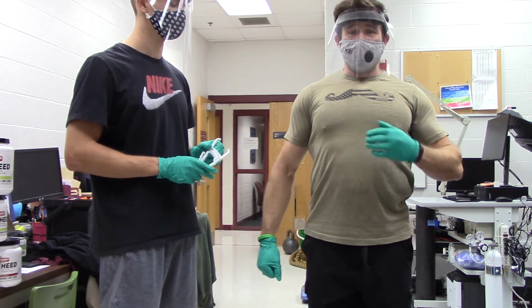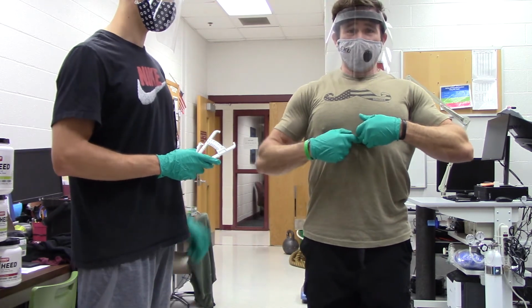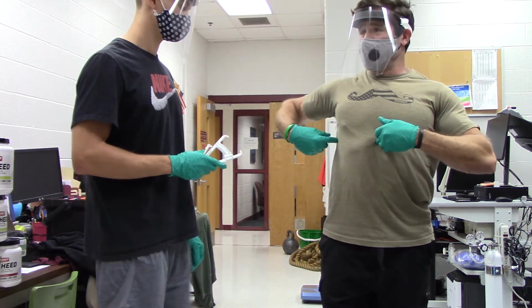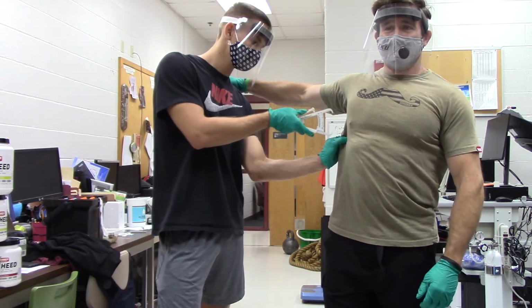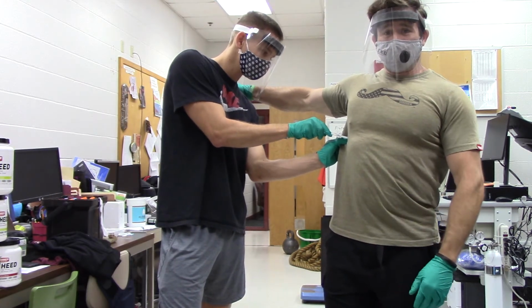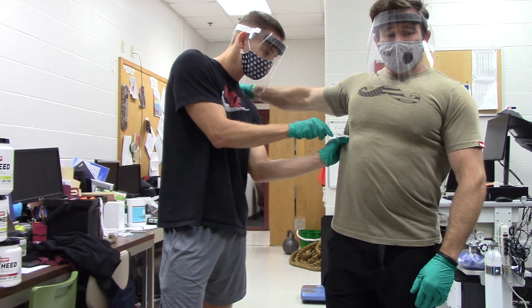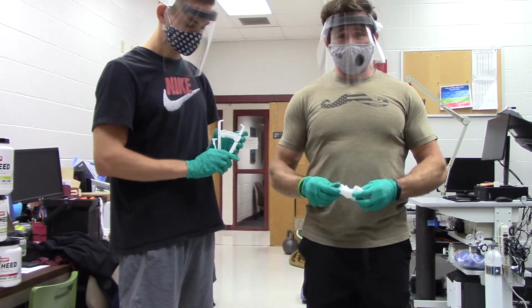Now the next one is going to be the mid-axillary. So we find the xiphoid process, the bottom of the rib cage, and we're going right perfectly underneath the armpit. So I'm going to hold my arm out to the side so Ihor is going to be able to get underneath. He's going to go ahead and grab that vertical fold and take that measurement. Good. And once again, we will be writing these numbers down as we go through.